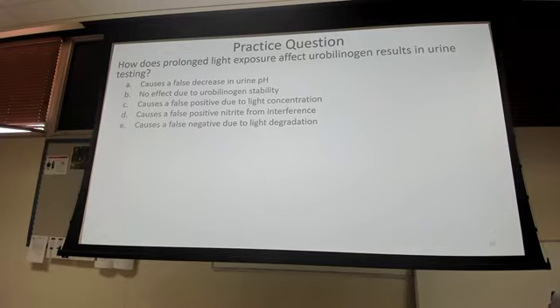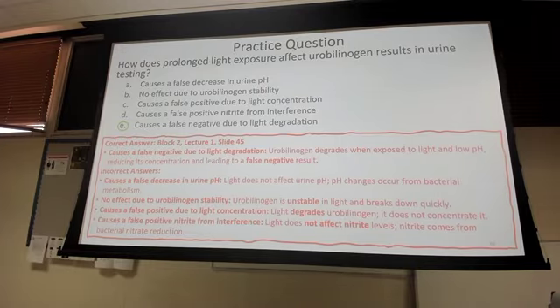All right, there's one question that was thrown in here. How does prolonged light exposure affect urobilinogen results in urine testing? Yeah. It causes a false negative due to light degradation. And there's the answer there.